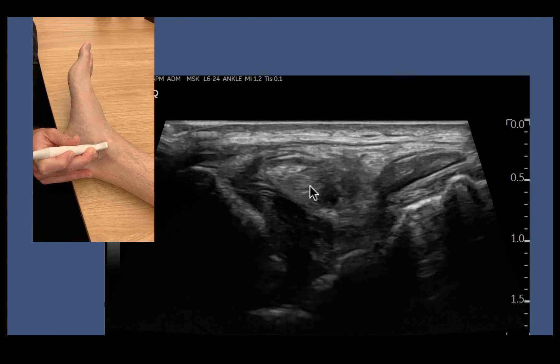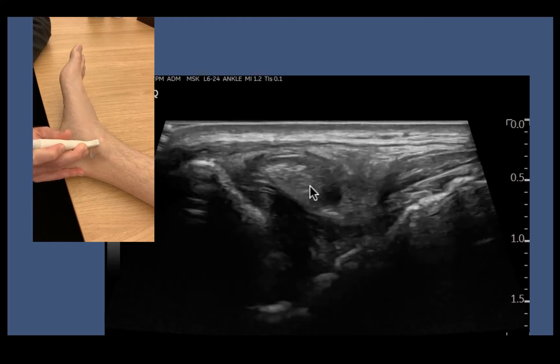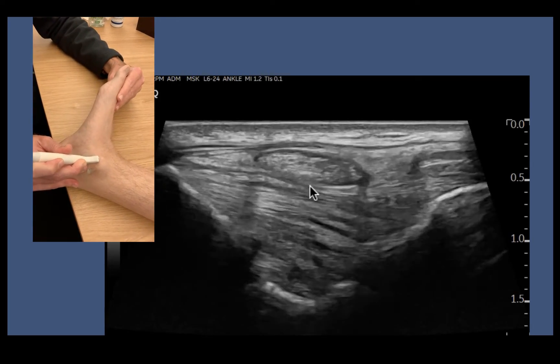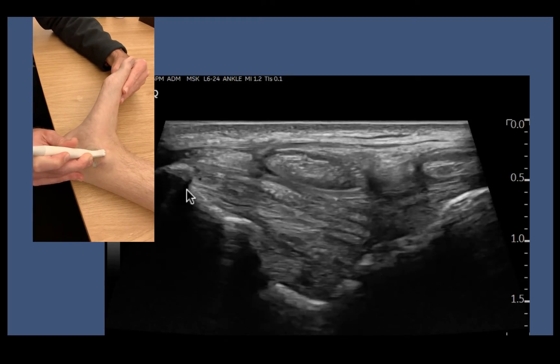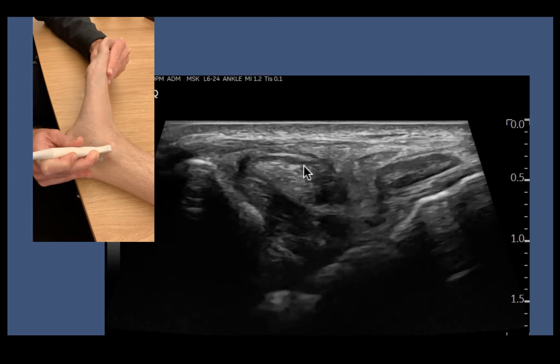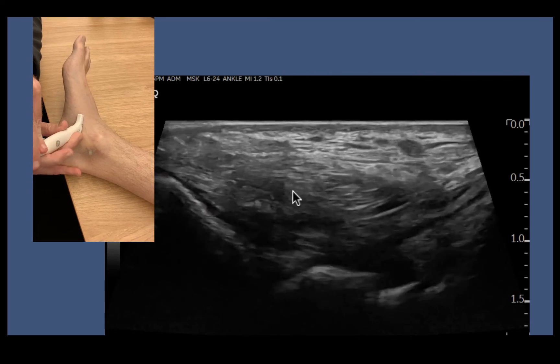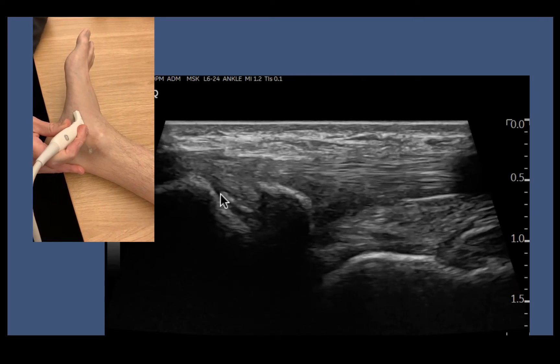Finally we'll get down to the foot and have a look at the back part of the deltoid — the posterior tibiotalar component of the deltoid. I'm just going to dorsiflex the ankle. I can see really nicely the superficial and deep components of the deltoid, our flexor retinaculum going around our tibialis posterior really nicely. Following tib post down, there's a nice little os tibiale externum before it inserts onto the navicular.